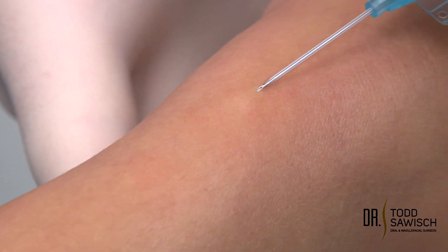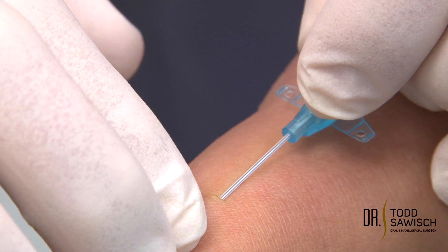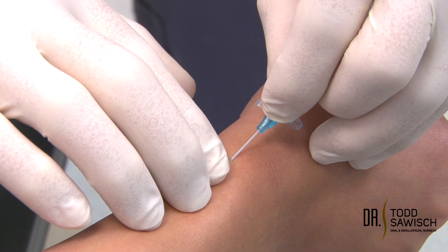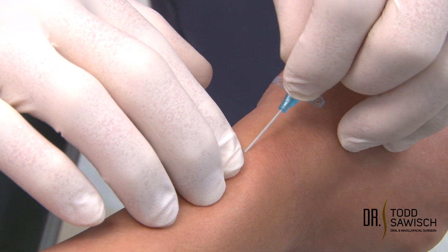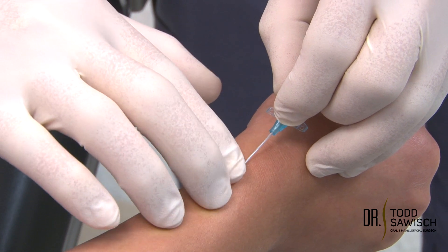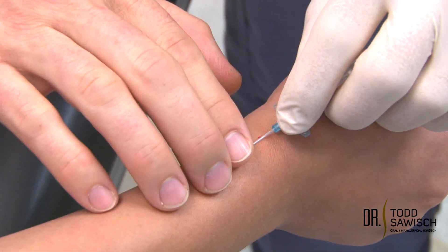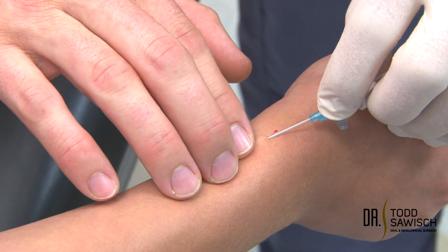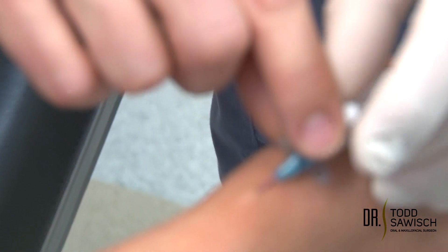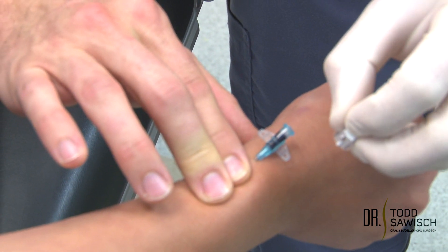I'm going to hold the wrist, insert into the vein, and we're going to look for the flashback. Sometimes when you have gloves on you can't feel where the vein is, so as long as you have one glove on it's usually acceptable as long as you don't get blood on you. You can see the flashback in the needle. I'm going to insert the catheter forward into the vein, and as I pull out you're going to see the blood start to come out. I'm going to put pressure here, pull out the needle, and retract it for safety purposes.